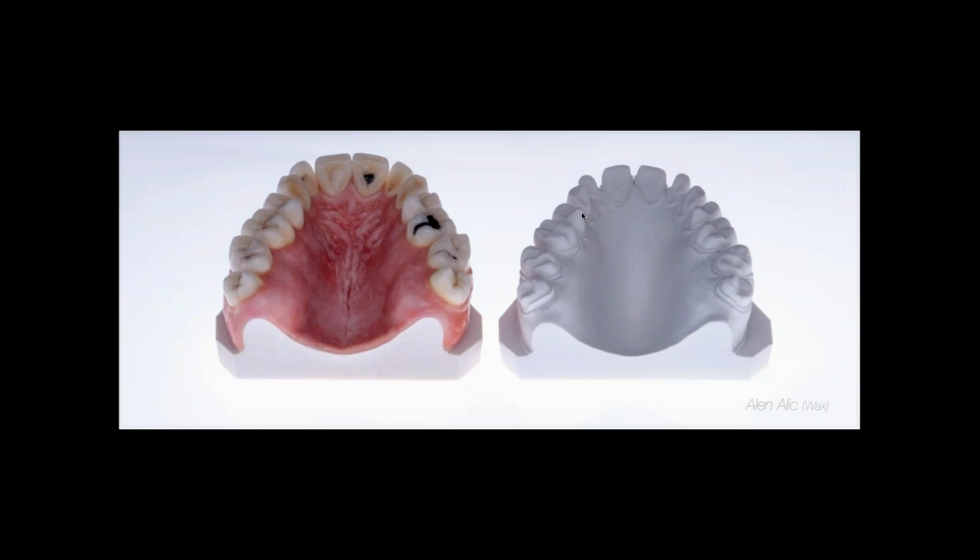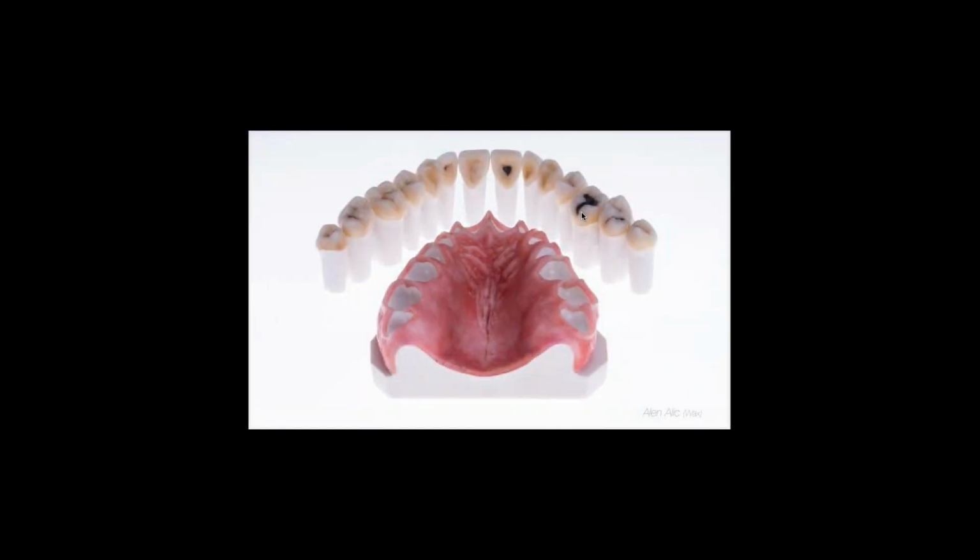I like using wax-up for mimicking the natural tooth. With wax, you can really train yourself, and you have different dentin colors or incisal colors. You have gingiva colors. This is one slide that I want to show you of what I like to do. Actually, this slide is my portrait. It's not so nice, but it's me, my self portrait.